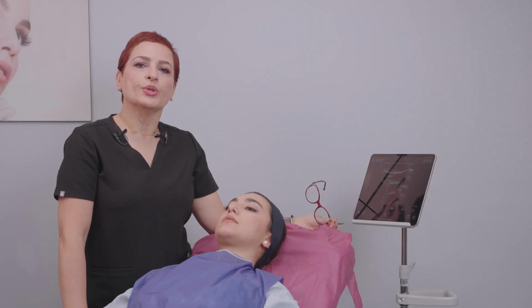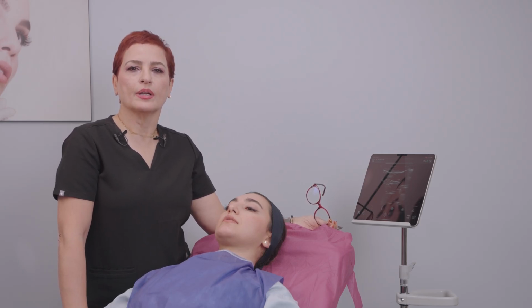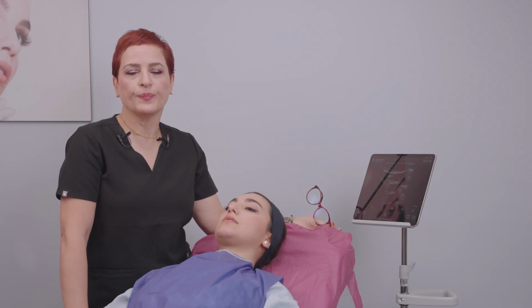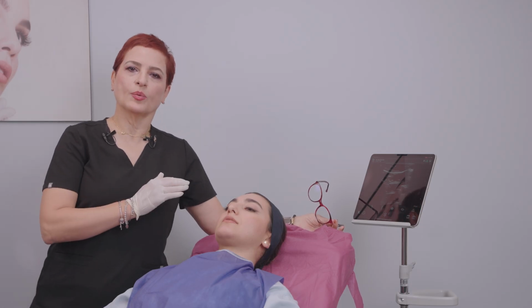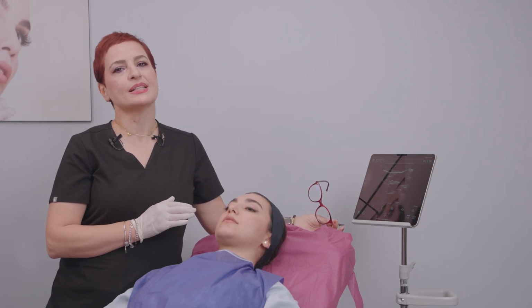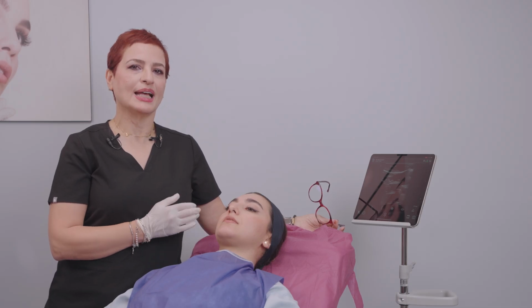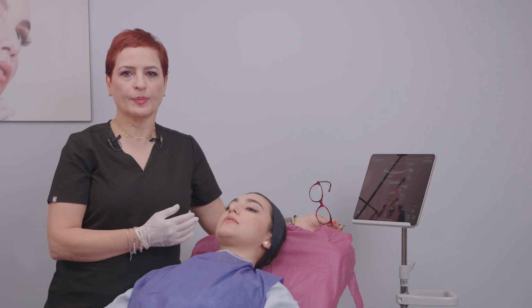As we all know, the buccal fat pad is surrounded by different tissues and structures. The posterior, or lateral, part of the buccal fat pad is the masseter muscle, which I'm going to scan and use as a landmark for scanning the buccal fat pad.